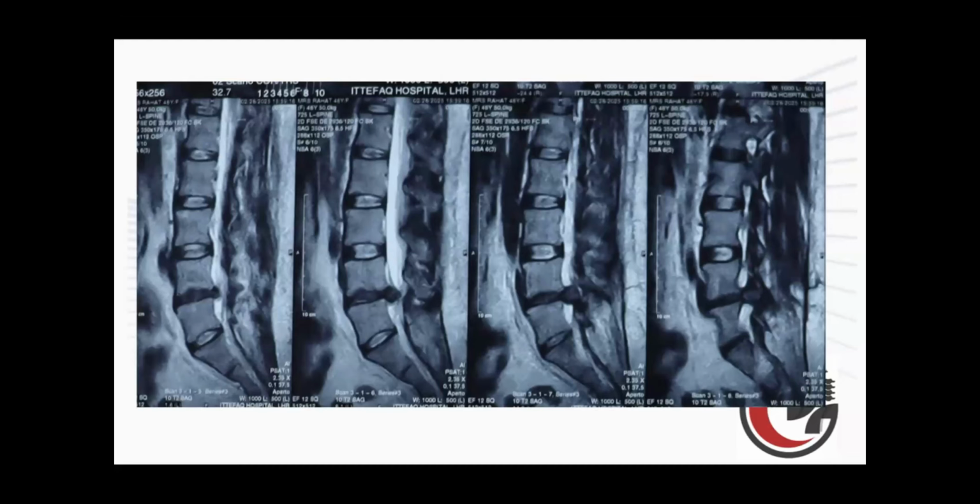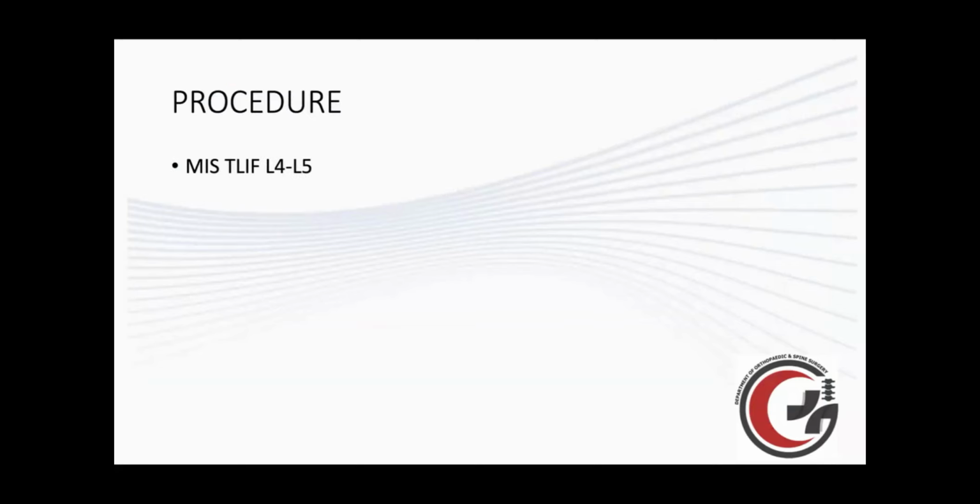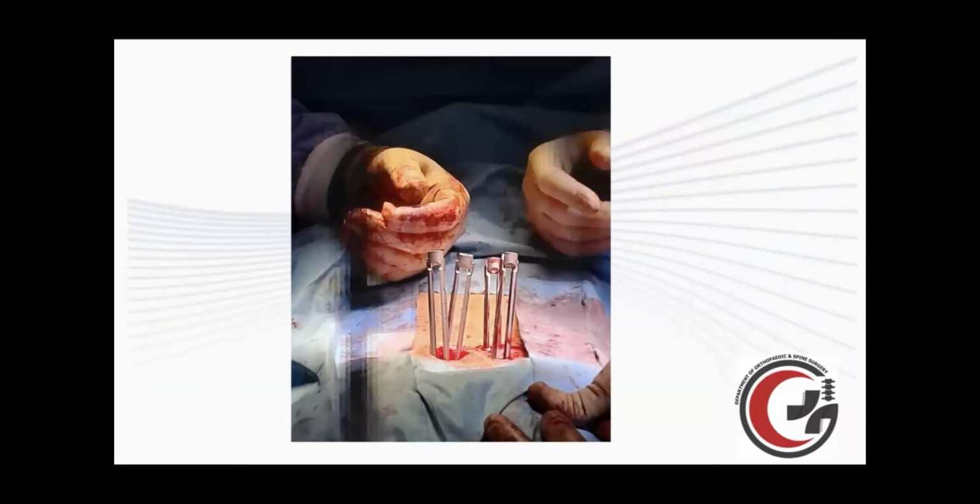L4, L5 disc causing compression of the thecal sac, along with the Modic changes which were visible at the lower end plates of the L4 vertebrae. So this time we chose a more targeted approach for her residual disc, which was minimally invasive transforaminal interbody fusion. And this is an image showing the percutaneous placement of the transpedicular screws.